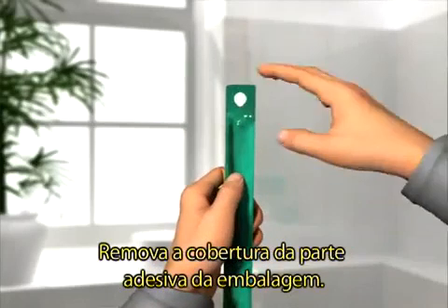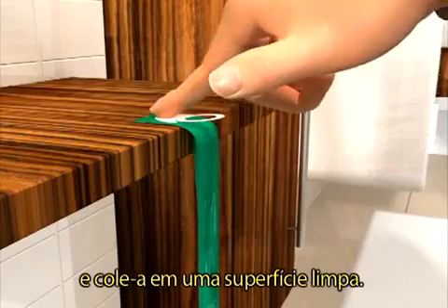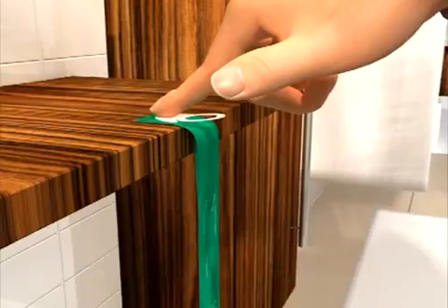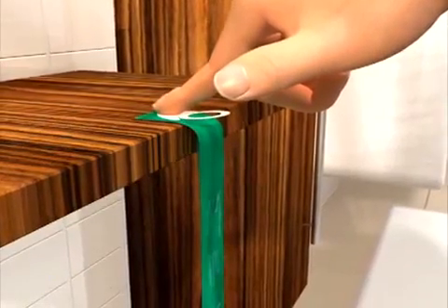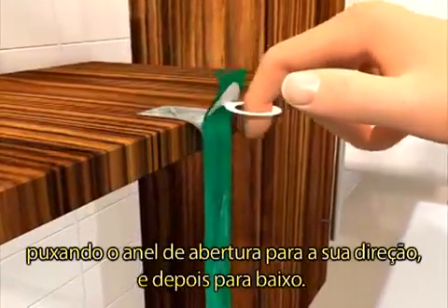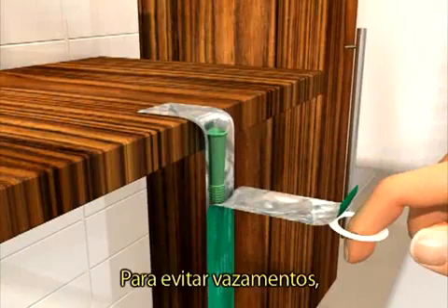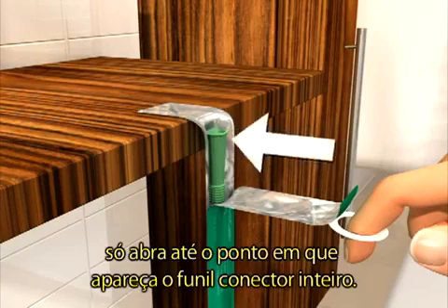Remove the cover label from the adhesive spot. Then attach the adhesive spot to a clean surface. The pouch must hang vertically and so that you can easily reach it when you're ready to use it. Open the upper end of the peel pouch by pulling the ring towards yourself and then downwards. To avoid spillage of the liquid inside the pouch, only peel until you see all of the funnel connector.